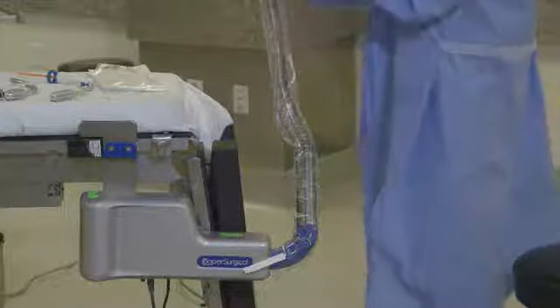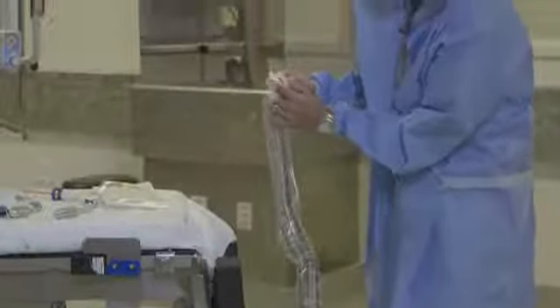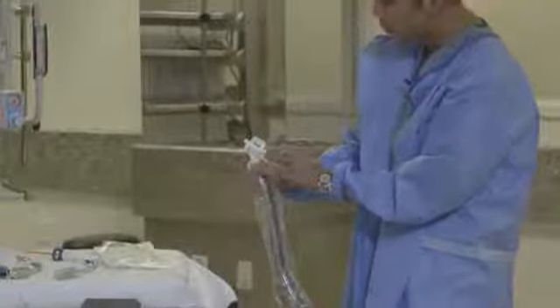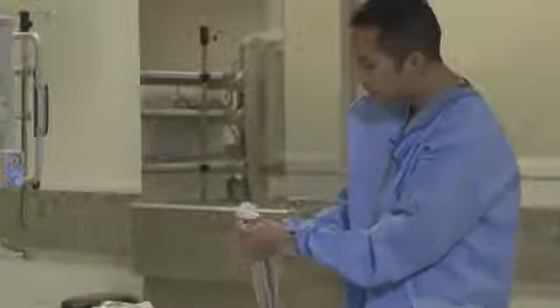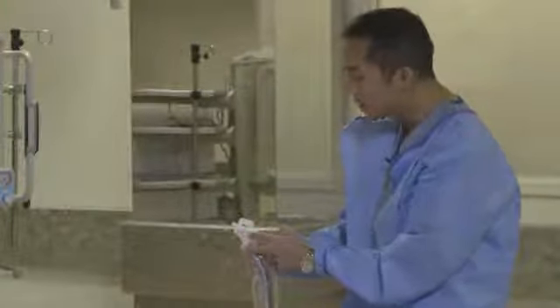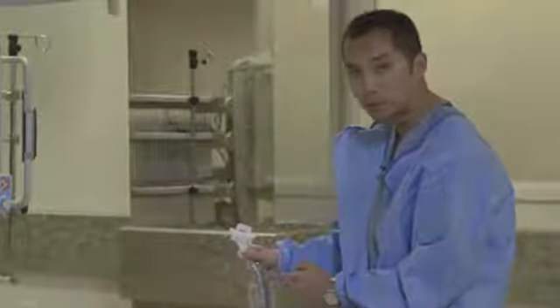And then the next thing that's important to do is make note of the drawings on the side here. What you're going to notice is there are drawings that indicate whether or not you're going to be using this particular adapter for the Advincula Arch or the RUMI system. In other words, you want to make sure that this is lined up to accommodate the particular handle for the uterine manipulator that you're using.